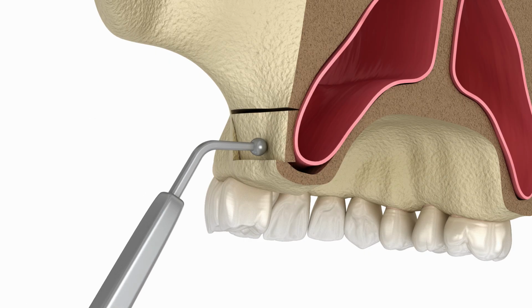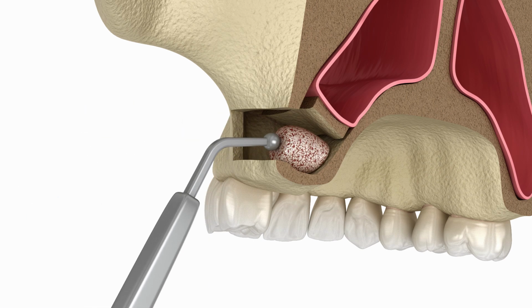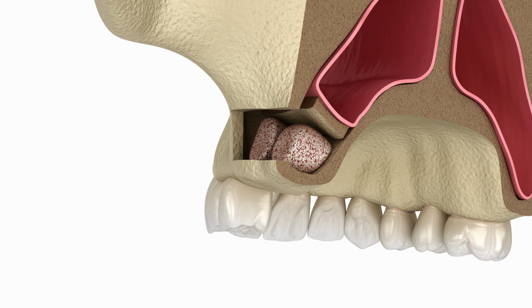Some cases, I need to graft bone, and so those cases can take a little bit longer. Like any case, we don't plan the case based on the bone. We plan the case based on where I need the implant to be. You can place an implant anywhere you want. It doesn't mean it's in the right position. And so ideally, that's where we look at the end results first, knowing where we need to place those implants. So in a lot of cases, I need to graft bone.